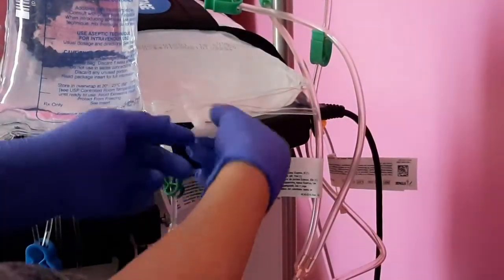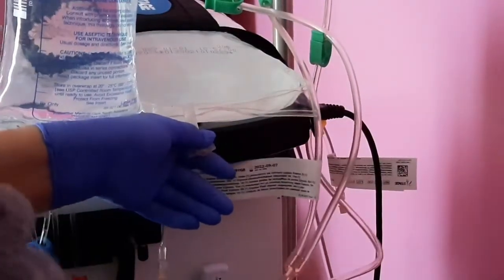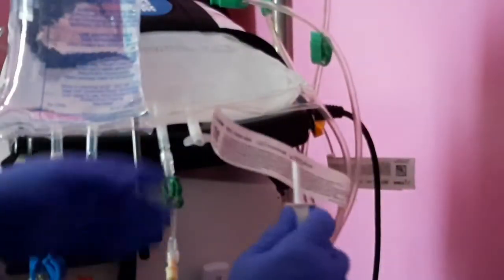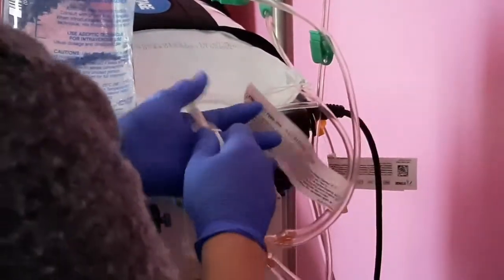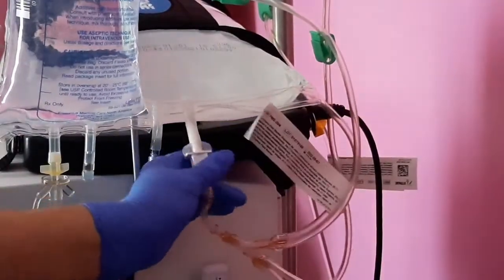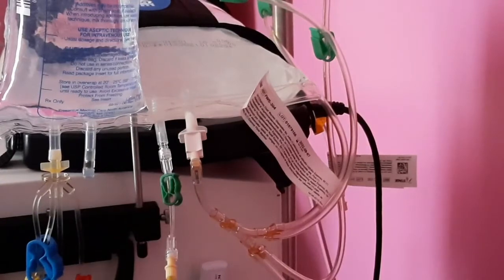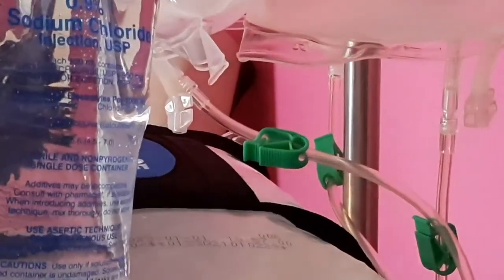And now I'm going to go to the wing part of it, hold the top wing, turn the bottom wing to twist it off. Then we're going to take the spike. Here's another spike. We're going to take the cap off, and we're going to insert it again, push in and twist, left and right, all the way till you get it right in there. We got our spike in there. Now we're going to break our frangibles. That's next.